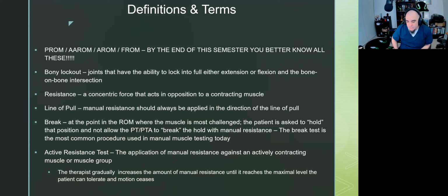Resistance, when we're talking about this, is going back to that whole lever type thing again. Resistance is that concentric force that acts in opposition to a contracting muscle. So right now I've got a digiflex because this is my exercise right now, right? When I squeeze down, I am concentrically contracting my finger flexors, right? The resistance is the springs in this that are resisting my concentric contraction, right?